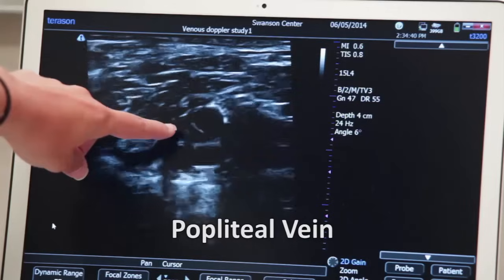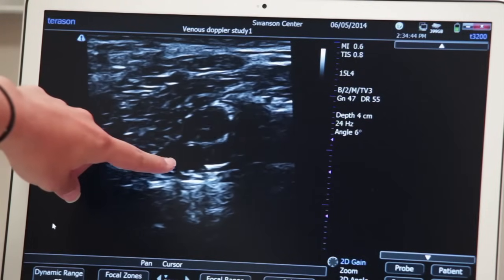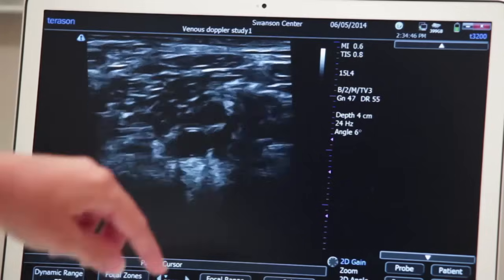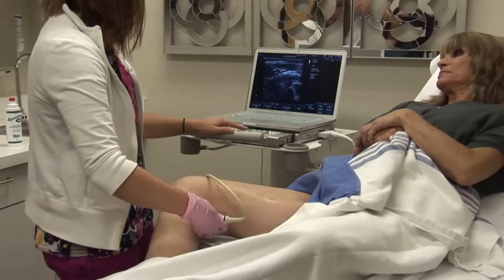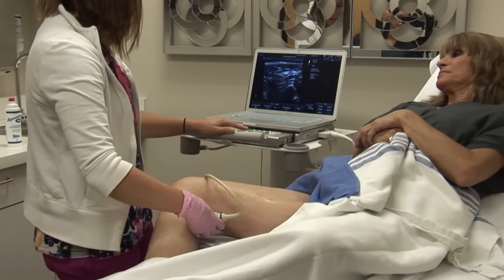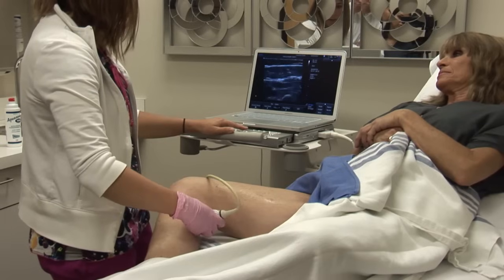I'll show it compressing. Now it is superficial to the artery — you can see the artery pulsing. I usually follow it distally towards the calf, where they bifurcate.